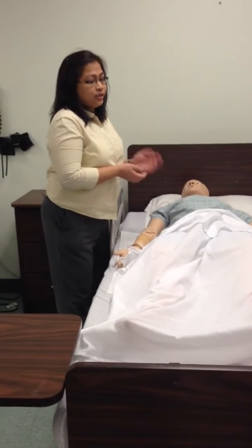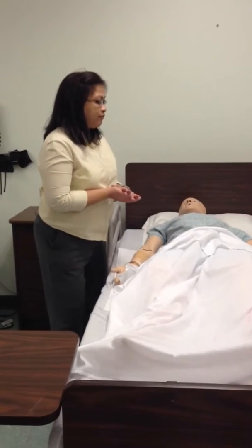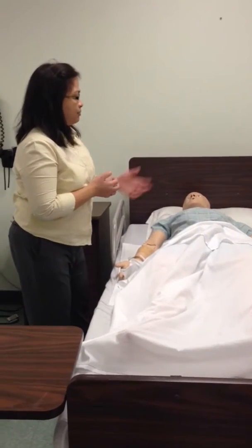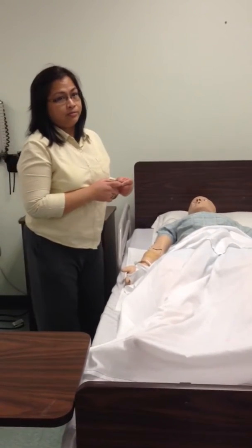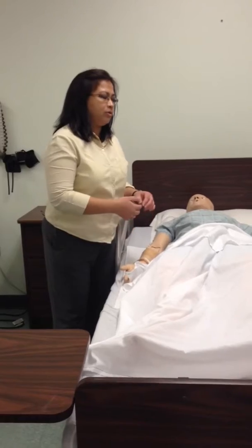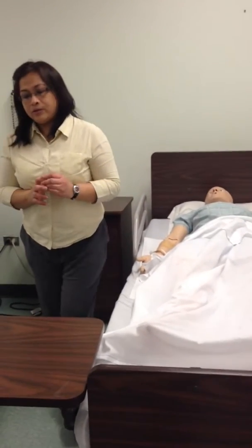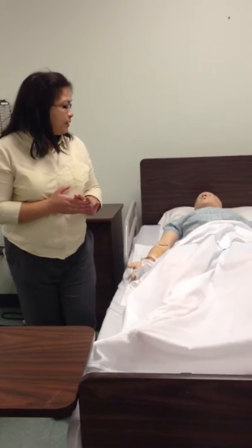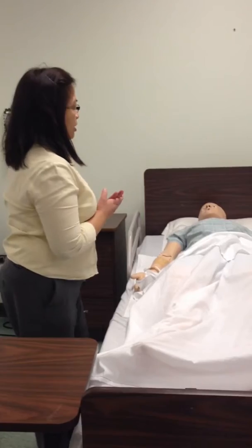If the teacher asks you things like, what do you have to check? What else do you have to check? You have to check if the patient has pain, because if she does, you need to medicate the patient first. Okay. And you wait 30 minutes before you start the procedure. So everything is okay with the patient, and now we're gonna move on.